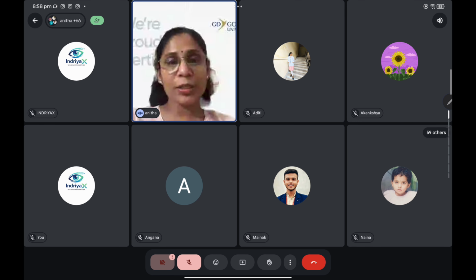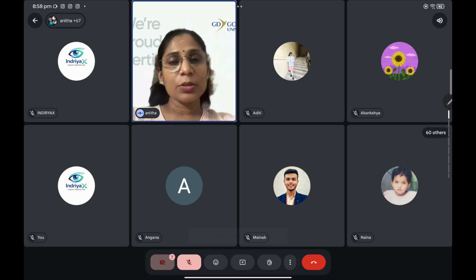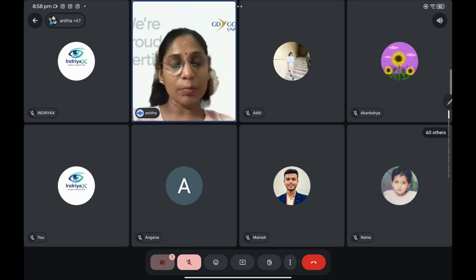So without fluorescein is a big challenge. Fluorescein is required for your tear breakup time. If you do not have usage of fluorescein, then you need to have a meibographer or any equipment for dry eye assessment diagnostics. So not using fluorescein is not a recommended norm. That's the least that we can use. Fluorescein and lissamine green should be generously used in our clinics to assess. You will miss out on corneal epithelial staining, conjunctival staining, lid wiper region staining. All of it will be missed.